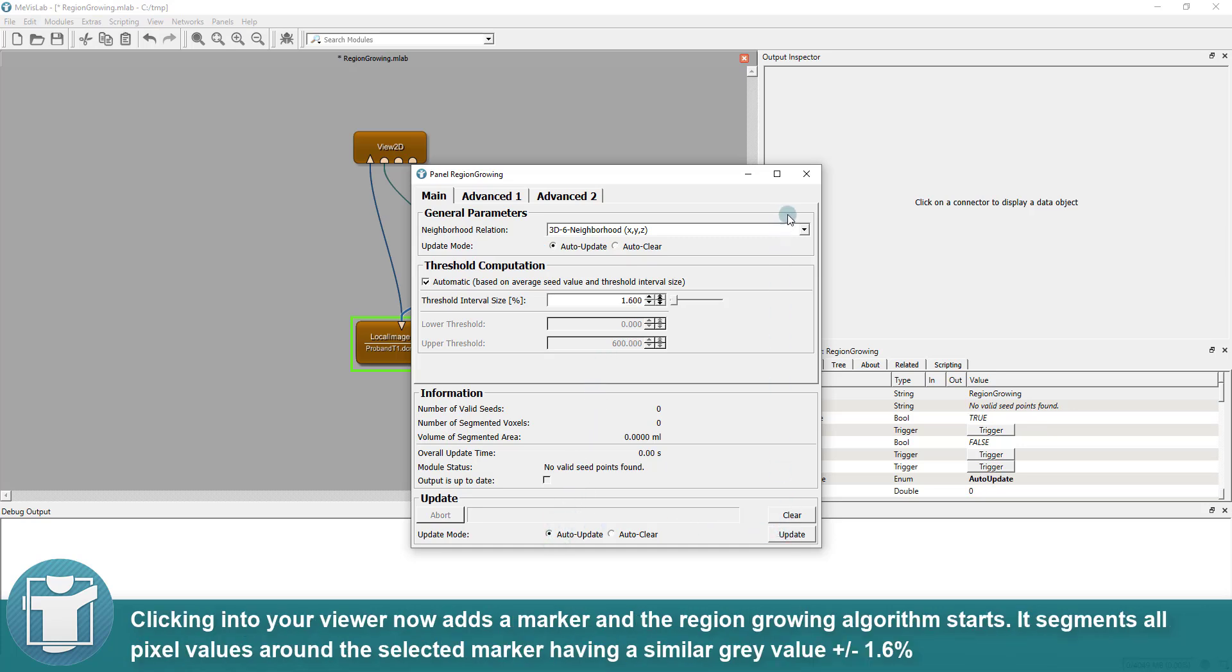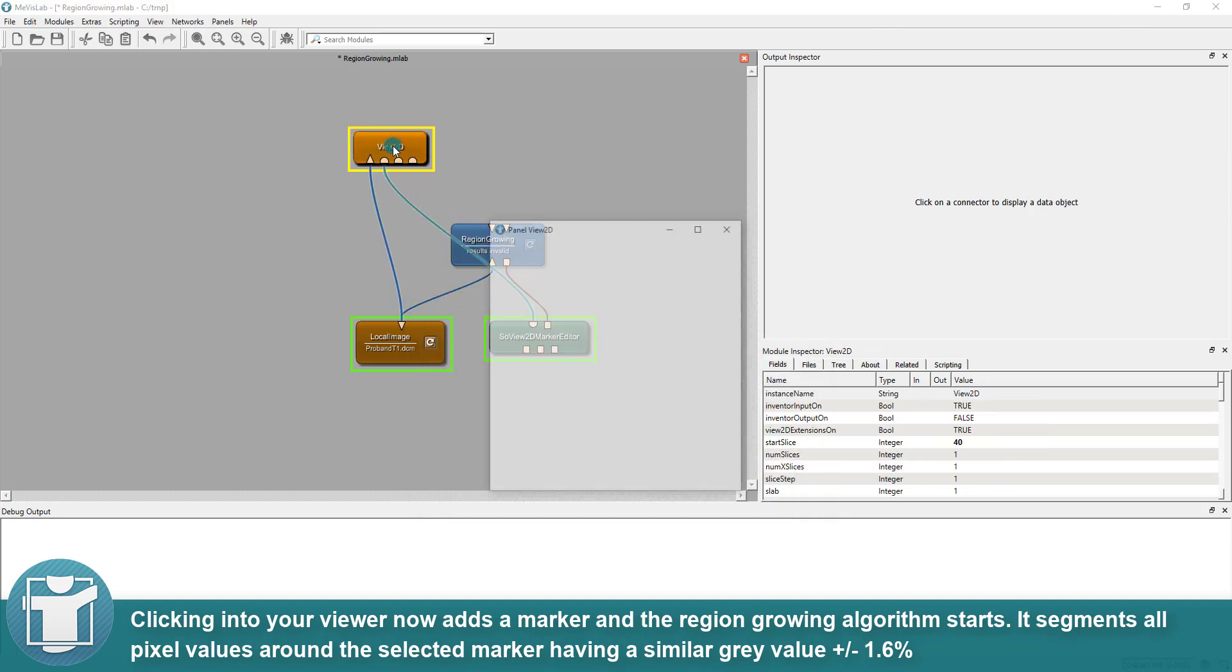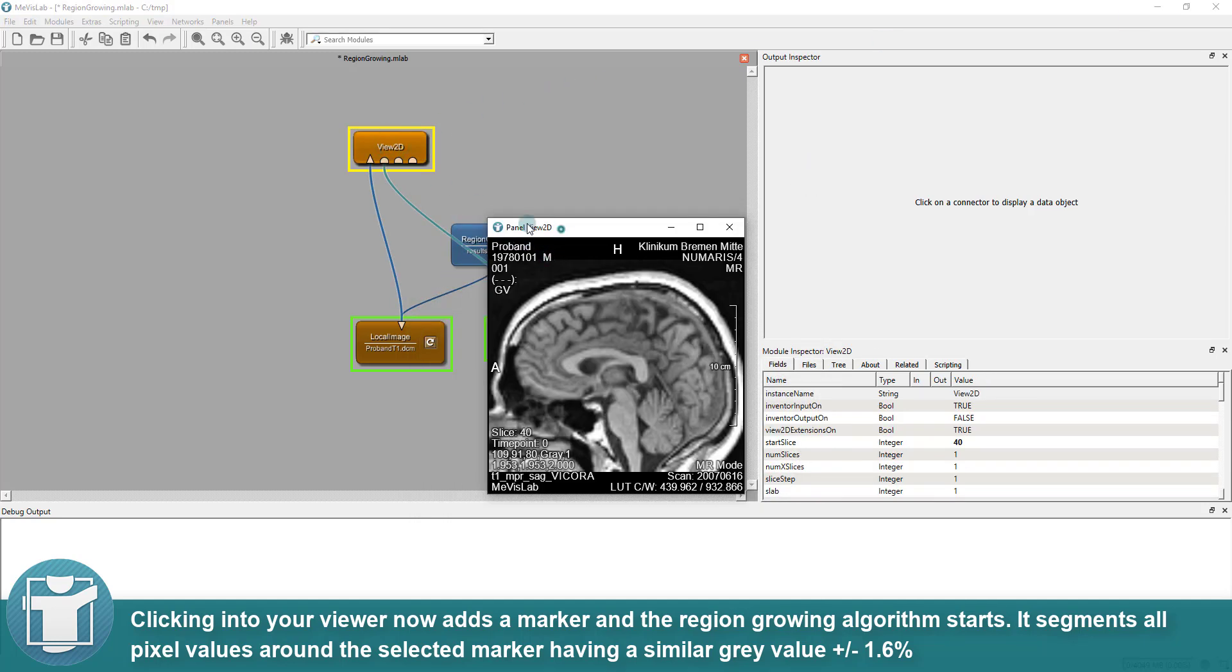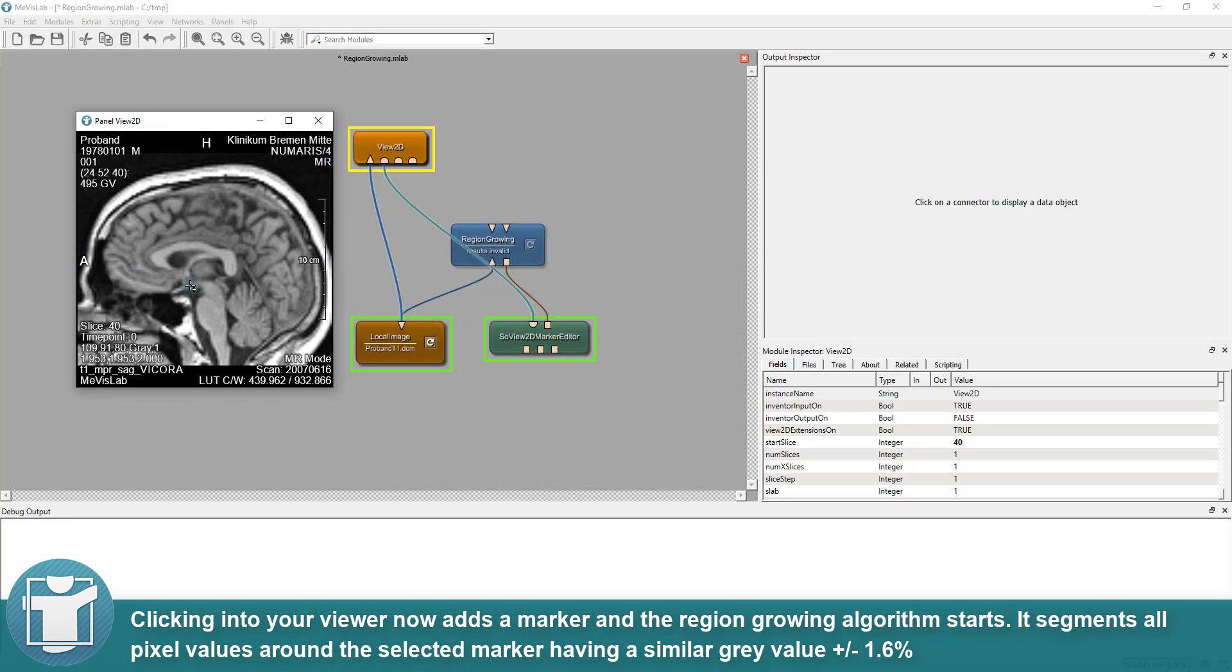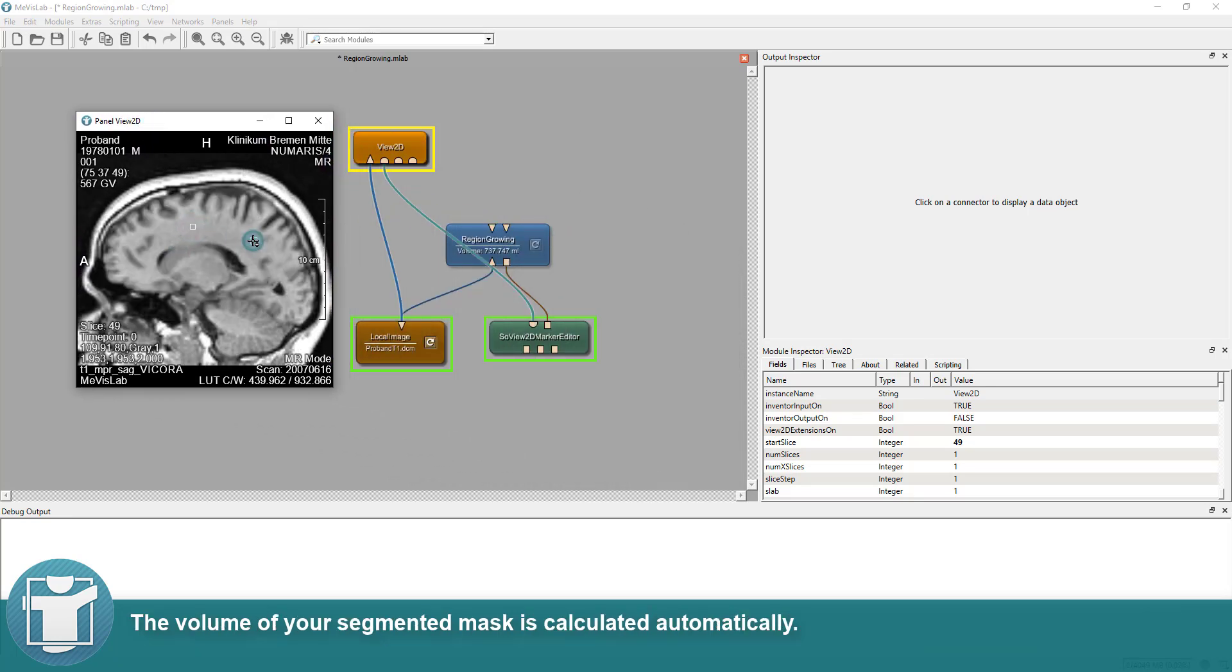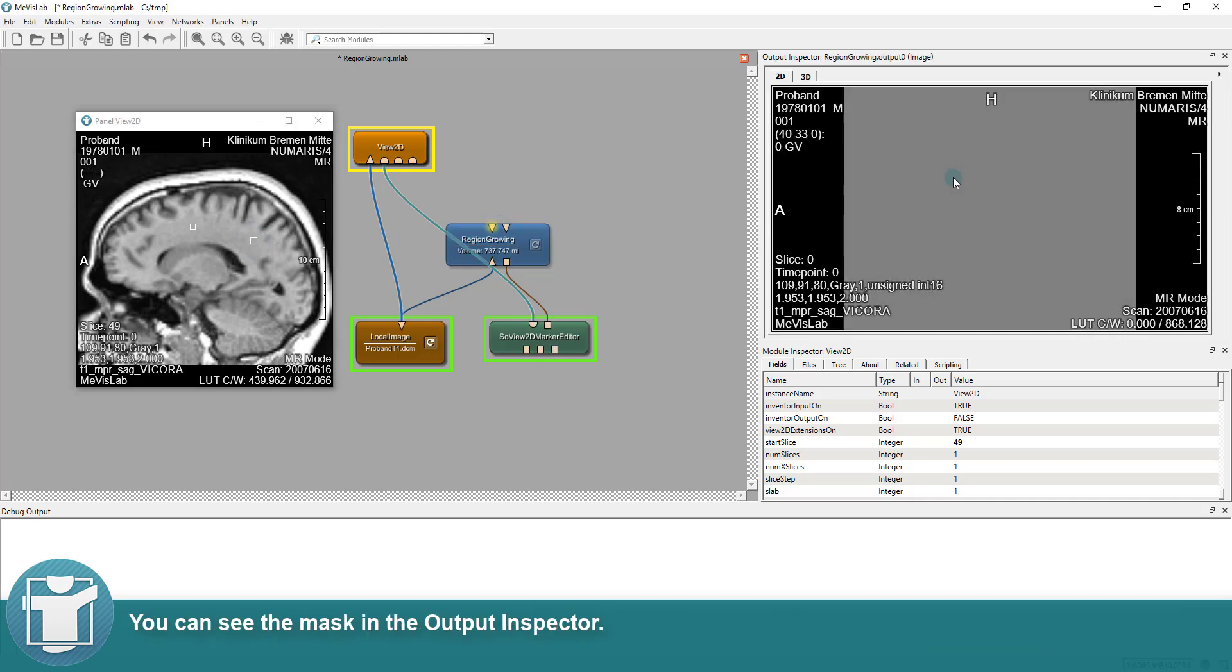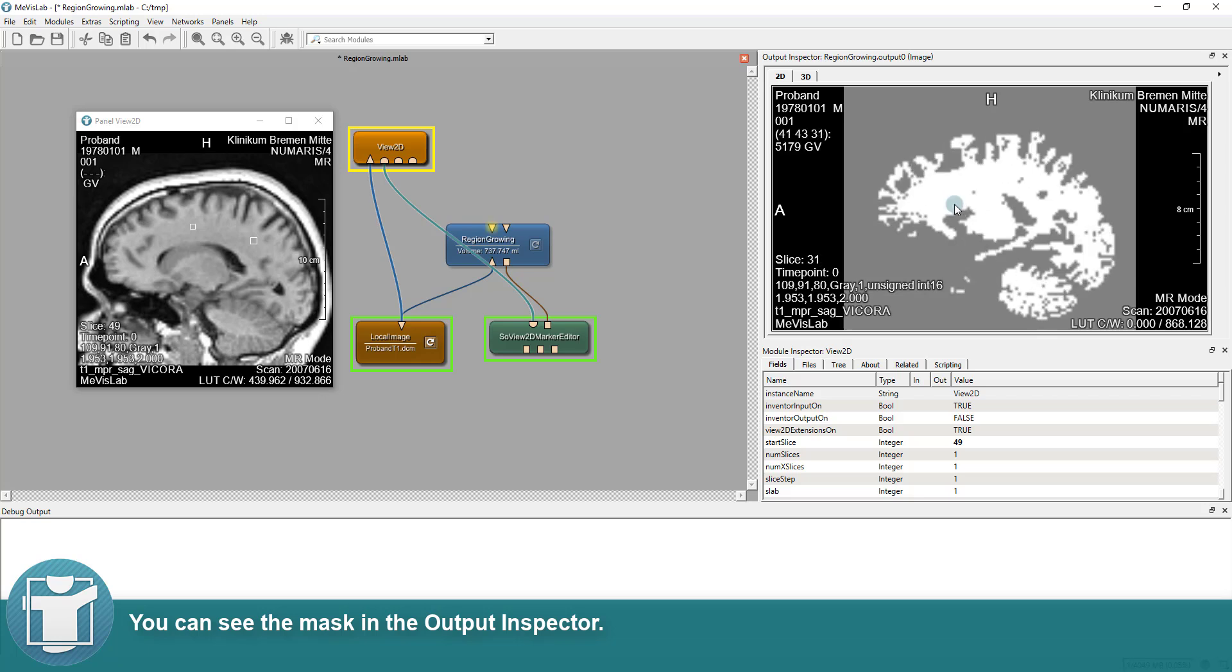Clicking into your viewer now adds a marker and the region-growing algorithm starts. It segments all pixel values around the selected marker having a similar gray value plus minus 1.6%. The volume of your segmented mask is calculated automatically. You can see the mask in the output inspector.